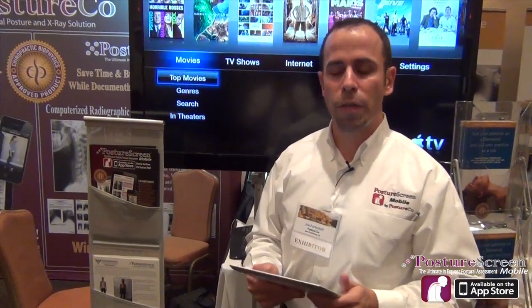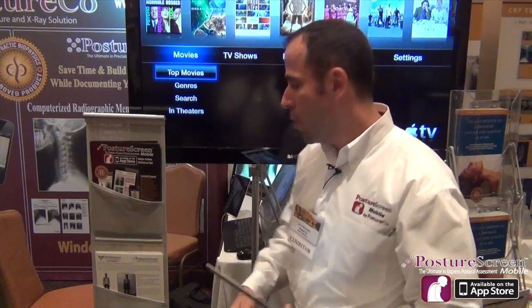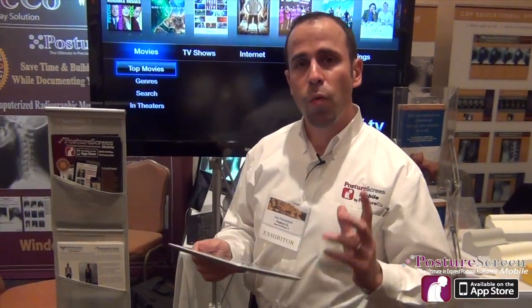The next thing we're going to do is tell the iPad to push video to the Apple TV. Now, remember, this only works with the iPhone 4S as well as the iPad 2.